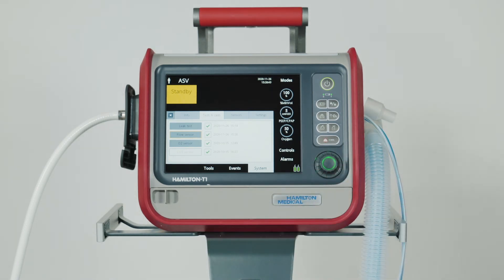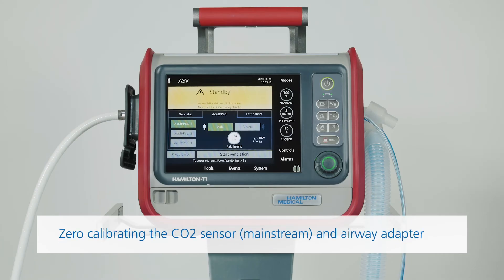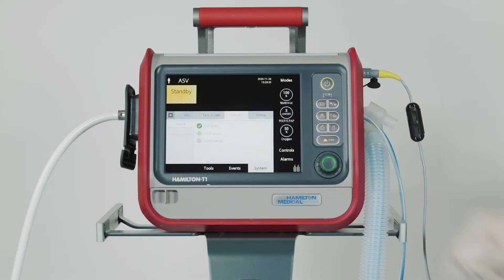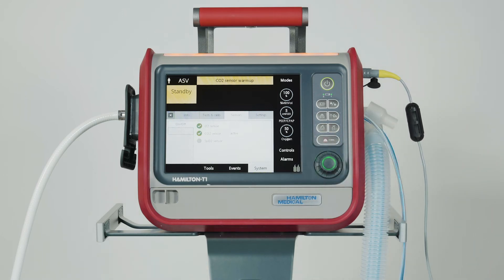When calibration has been completed successfully, a green check mark will appear in the box. The CO2 sensors are already calibrated before the ventilator leaves our factory, so you only need to zero calibrate the airway adapters. First, connect the sensor to the ventilator and check whether CO2 monitoring is enabled. Then wait about 90 seconds for the device to warm up. If you haven't already connected the airway adapter to the CO2 sensor, do that now. Make sure you keep these components away from all sources of CO2 and the exhaust port of the expiratory valve.